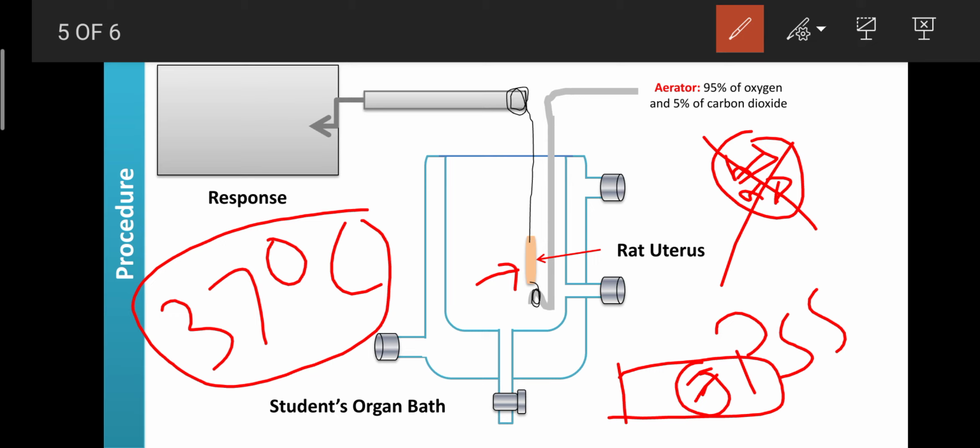If it is not present, it indicates the animal is not having an estrous cycle, or the cycle has not started. Then you can give stilbestrol, an estrogen derivative, which is available in the market. That stilbestrol is dissolved in coconut oil, and the solution is given to the rat. Within 12 hours or 24 hours, the estrous cycle occurs in the rat, even if it is not at the normal time.